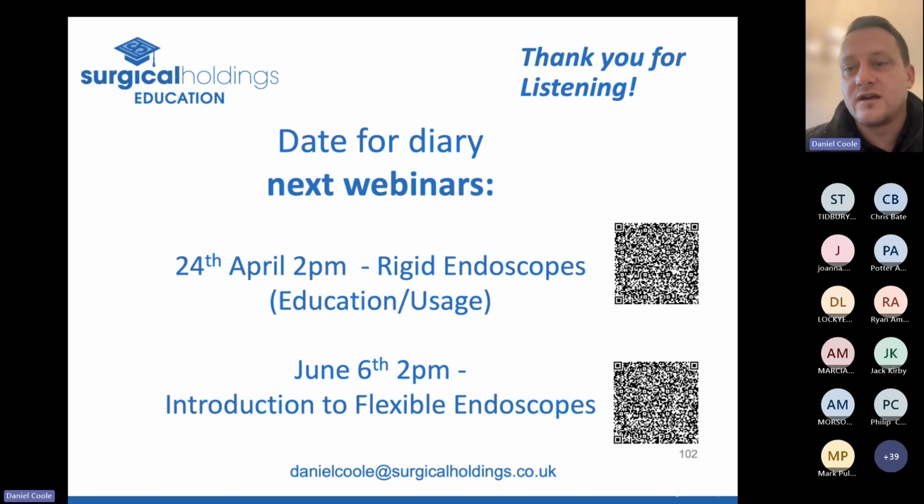That's where something like a key dot might, I suppose, if that was replaced regularly, give you clarity of mark. But I think all you can do is do a validated process where you're laser marking, and then you're cleaning the free iron, so you're oxidizing the layer, and you're checking that. And obviously, I think Chris has mentioned from GS1, making sure that's a correct GS1 mark, and then assuming that we may also be using these marks for tracking, making sure that they can be scanned at sterile services. But that's certainly something that is going to need further work, because there's all manner of different chemistries that come into contact, and as we mentioned, water quality, that's going to provide these challenges.